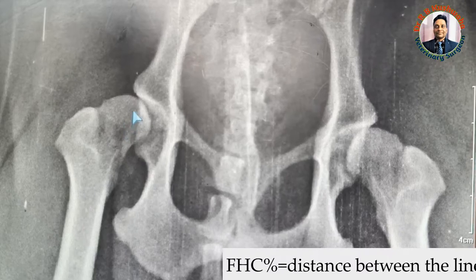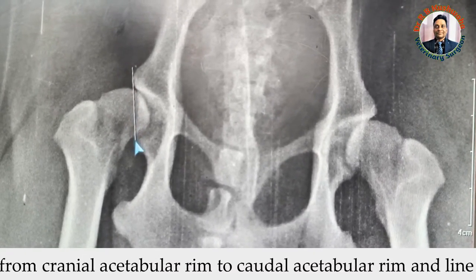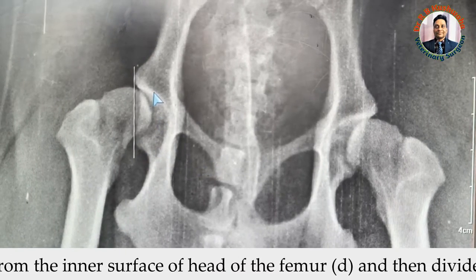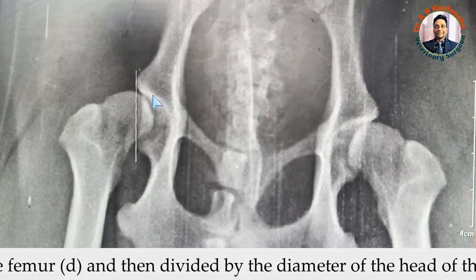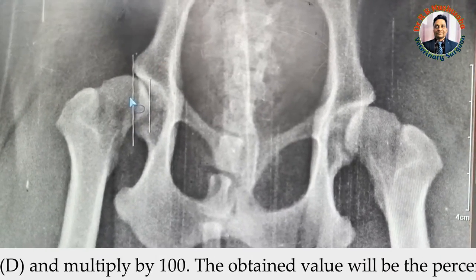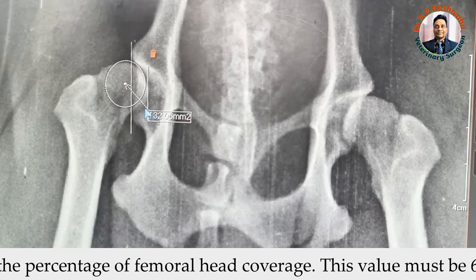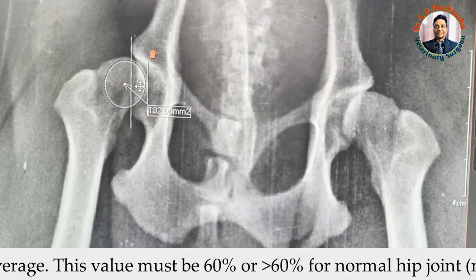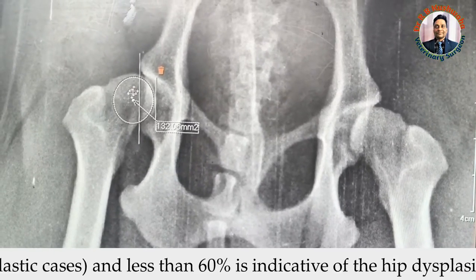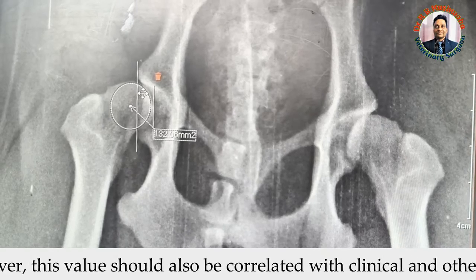For measurement of femoral head coverage, we first draw one line connecting the cranial acetabular rim to the caudal acetabular rim. Then a second line is drawn at the inner surface of the head of the femur. Then we draw a circle to measure the diameter of the head of the femur, centering it at the center of the femoral head.